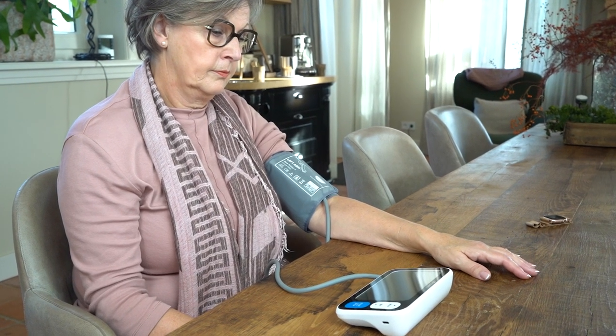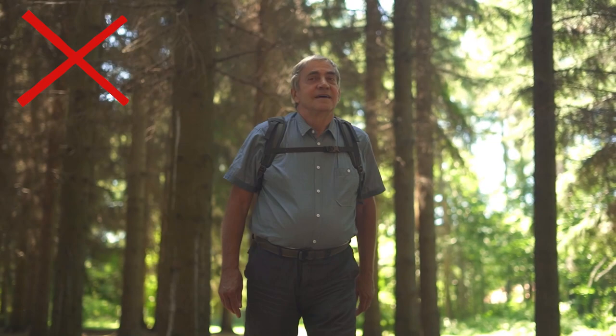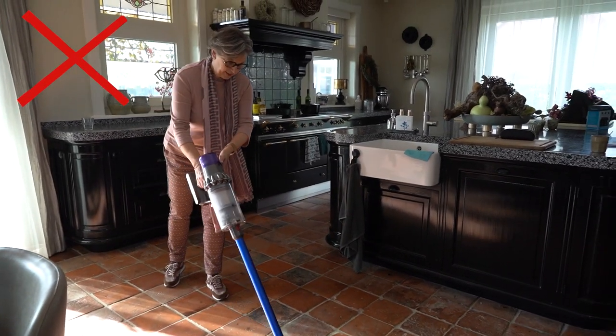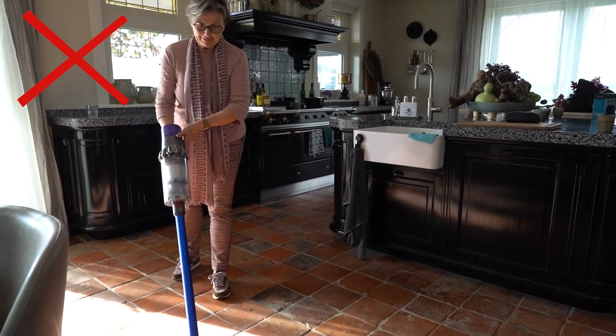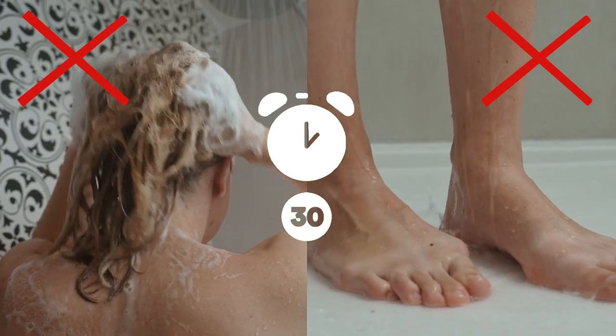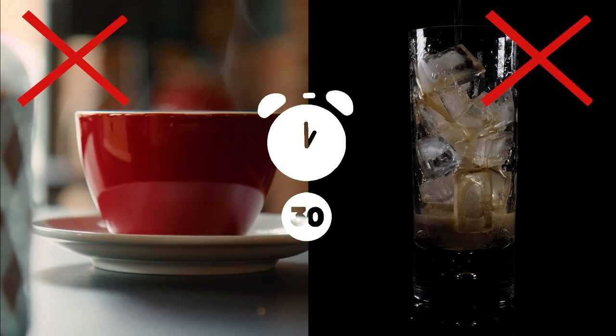The things you do before starting a measurement can have a huge impact on the accuracy of your readings. Before you start measuring, try to avoid strenuous activity. Do not shower or bathe 30 minutes prior to measuring. Do not drink hot or cold drinks 30 minutes before measuring.